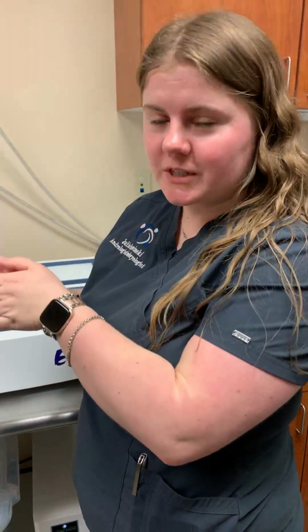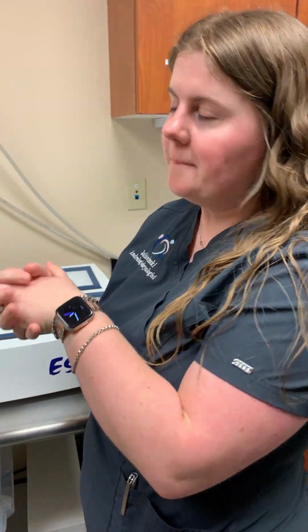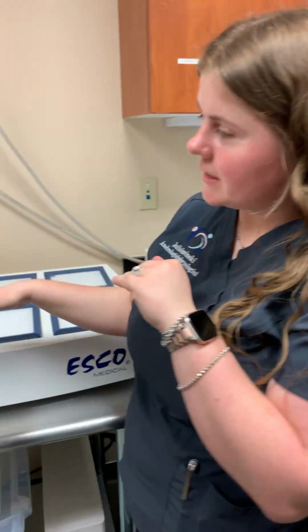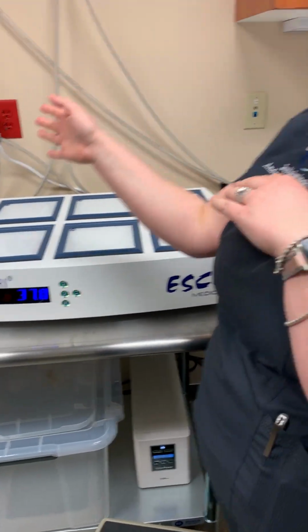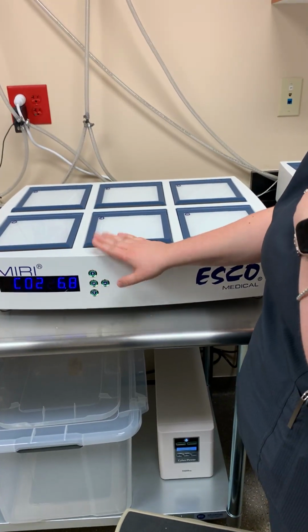So our gases come in from up top. There's a tank room on the other side. We also have an alarm system set up on that. A big red light comes on, we go to our backups. We always have backups set up. When it switches to the backups, we immediately order more gas in. That gas will come in and they'll hook that up, and that is now the new backup while the other ones, what was a backup, was running. And so we'll always have a full set backup on hand.